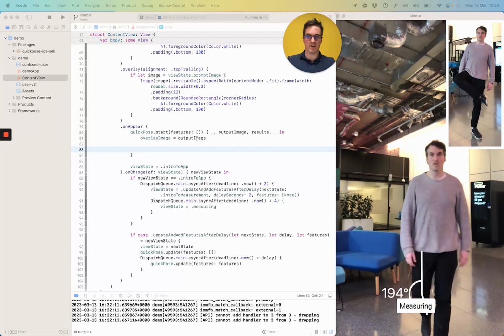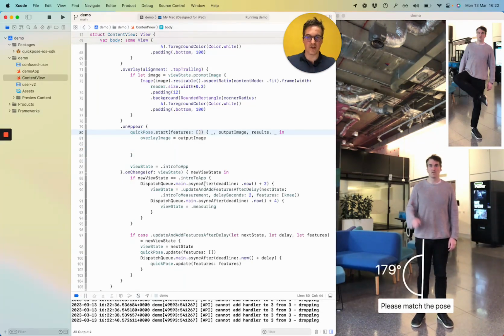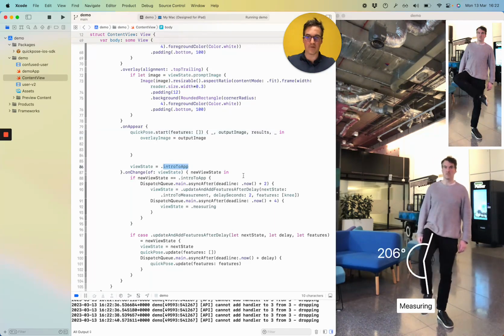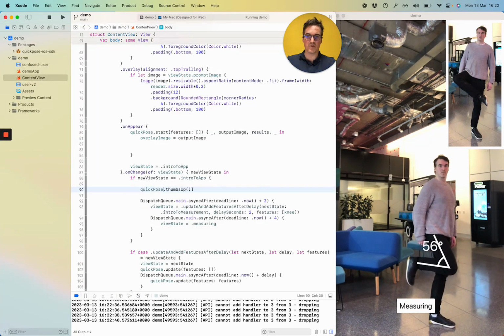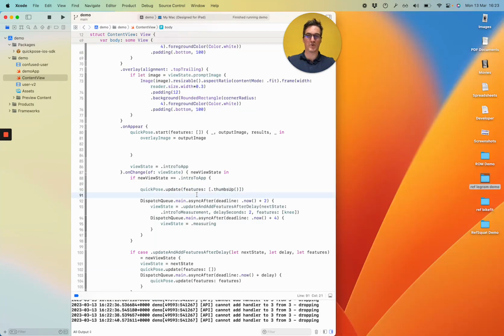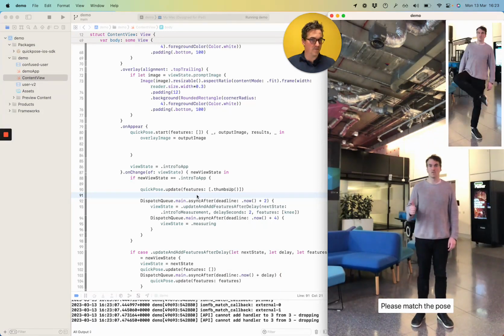So what I recommend is loading a feature in called thumbs up, and then that feature gets set on the intro to app step. So wherever I'm setting intro to app, I want the feature to be thumbs up. QuickPose, update features with thumbs up. Okay, cool. Well, let's see what happens there. Cool. This app measures your knee. Right. Please match the pose.